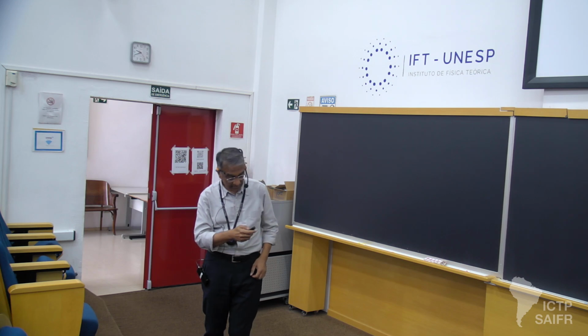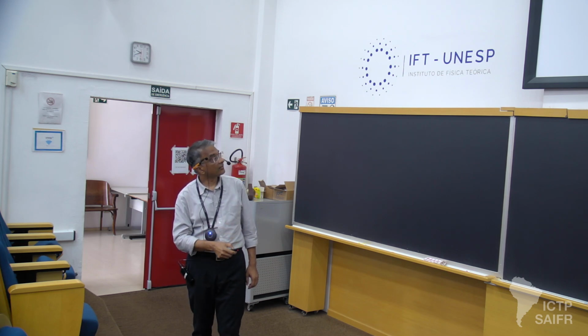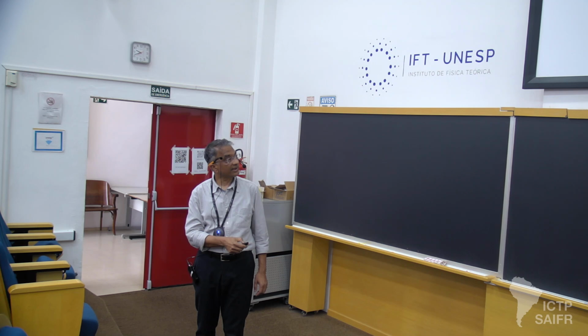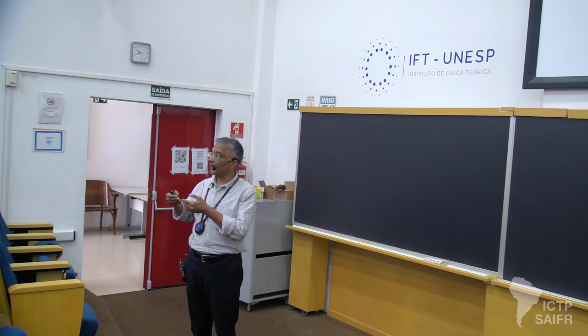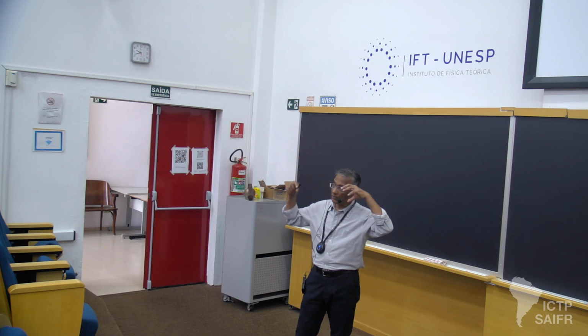This is a study that we did which shows that if you have intracranial contacts very close to a scalp contact, the ratio of the power that makes it from the intracranial source to the scalp is roughly 15% in the lowest frequencies, and then it drops to roughly 5 to 7% between 4 or 8 hertz to about 30 hertz, and this is probably all noise influence on the scalp EEG. So the intracranial EEG is capturing orders of magnitude more power than you are capturing with the scalp signal, just by going within the generator.